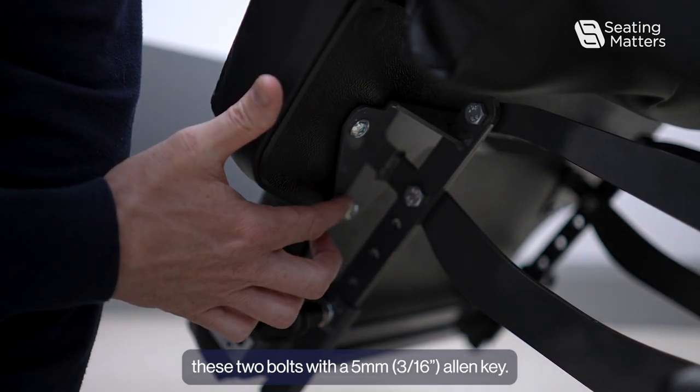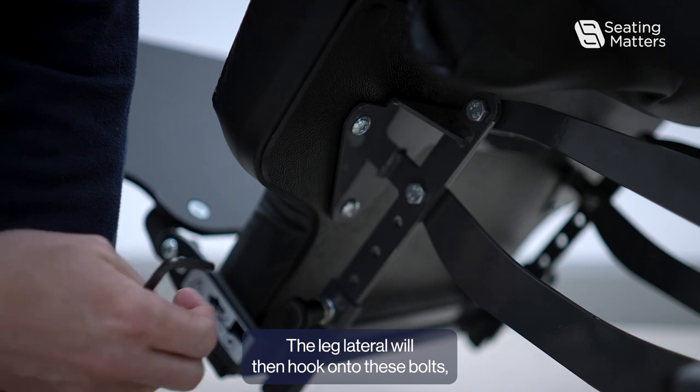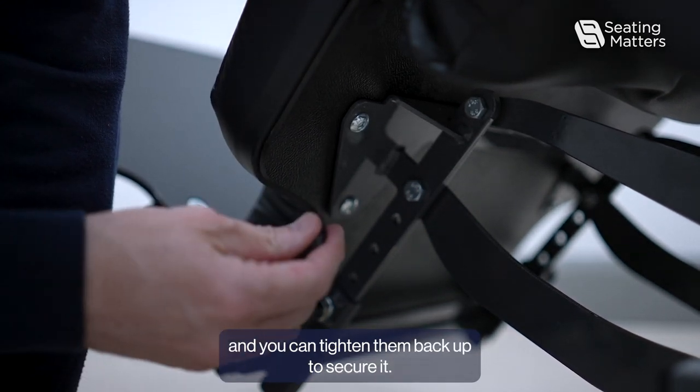you need to loosen these two bolts with the 5mm Allen key. The leg lateral will then hook onto these bolts and you can tighten them back up to secure it.